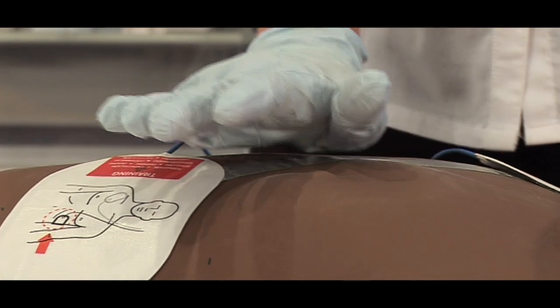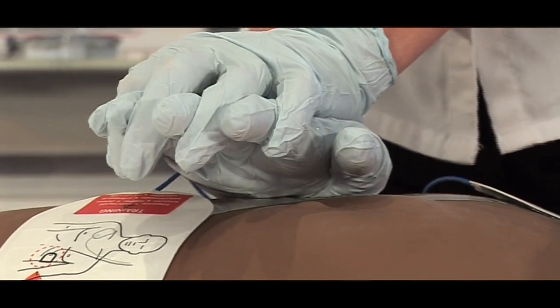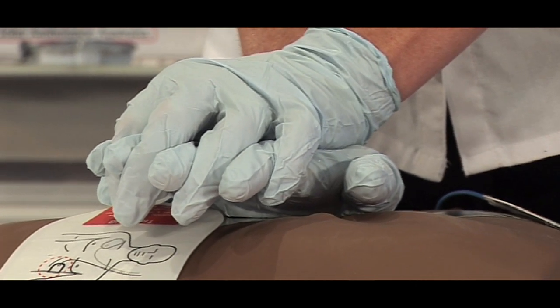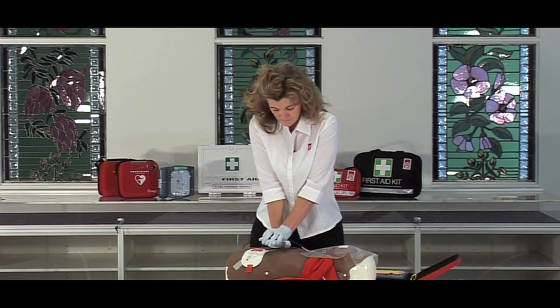Place the heel of one hand in the centre of the chest between the nipples. Place your other hand on top of the first. Push the chest down firmly five centimetres and keep time with the beat.